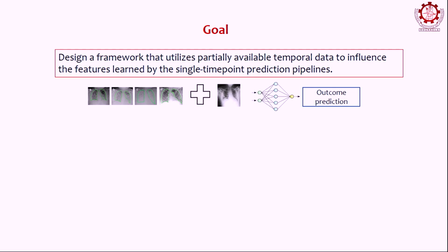There is some sort of calibration going on. They are not drawing their conclusion based on today's image only. They are trying to understand the features and calibrate today's interpretation based on prior knowledge, and that is what we want to do here.